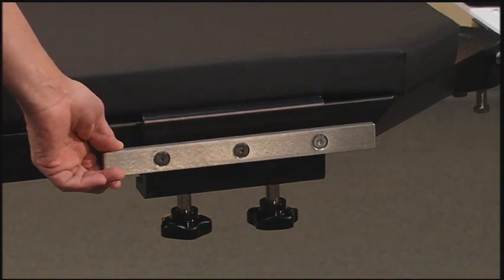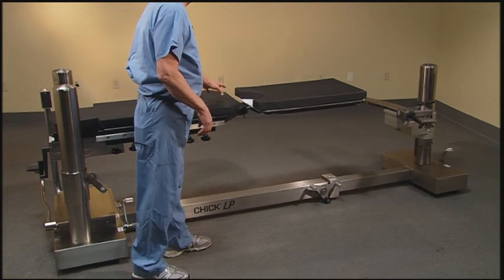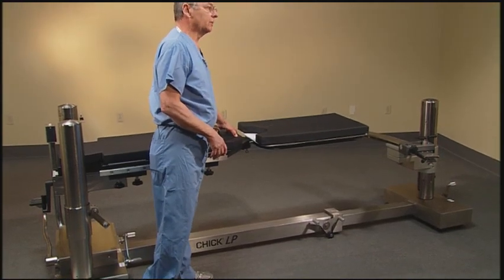Once the side rails are attached and the patient is brought into the room for intubation, once they're sedated, the patient will be pulled down to the perineal edge and we will drop in the perineal post.